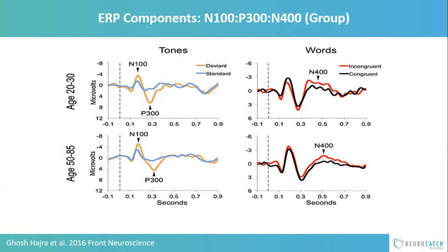So that early peak that you see is actually coding phonologically that the sound you expected to hear didn't fit. And then later, the peak where you see the arrow for the N400 is coding that the actual meaning doesn't fit. So we process and begin processing words about 200 milliseconds after we start to hear them. And so the reason the N400 has a broader peak and it's not as big an amplitude is because it's actually capturing a lot of complex cognitive processing.